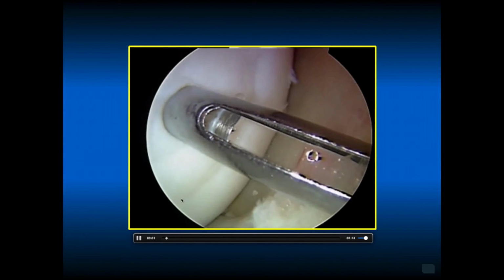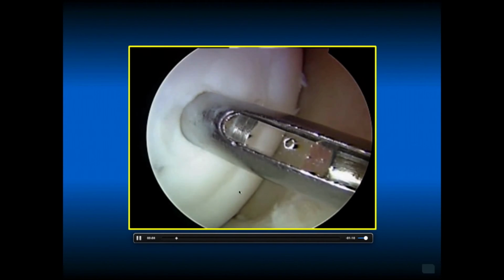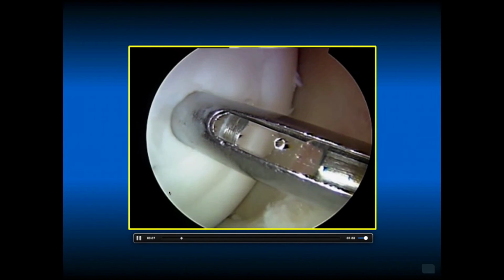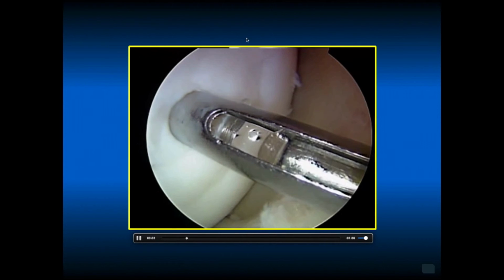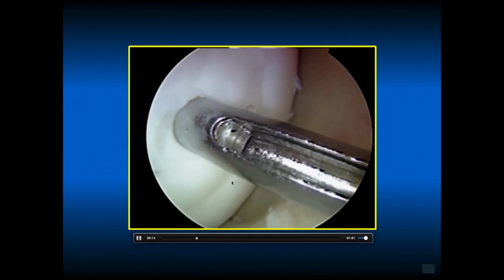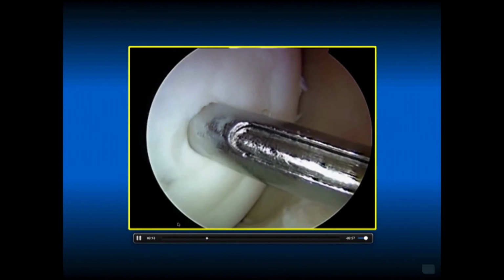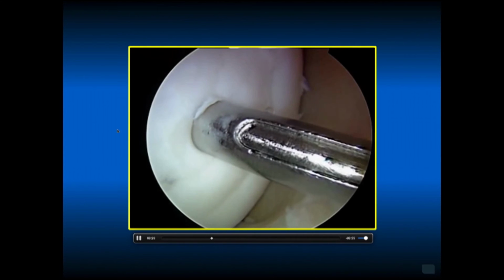And this looks like this is this undulation of the medial femoral condyle. So this is the OCD piece. The remaining is the parent piece. And this is fixation with a smart nail. So you drill it first and then put the smart nail in. In this case, this was not taken down.